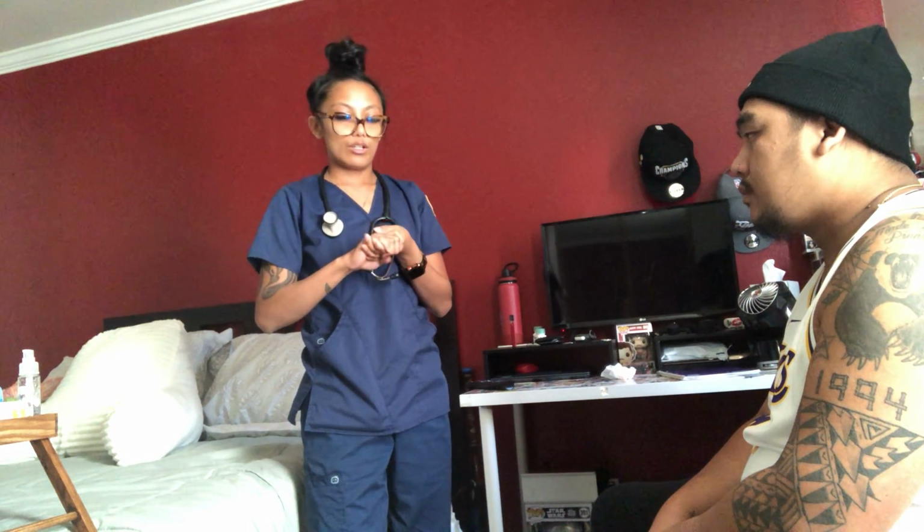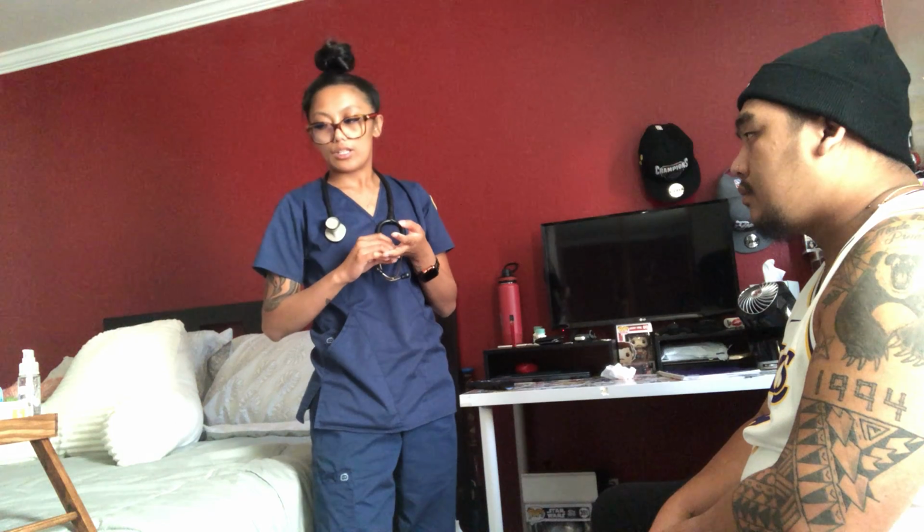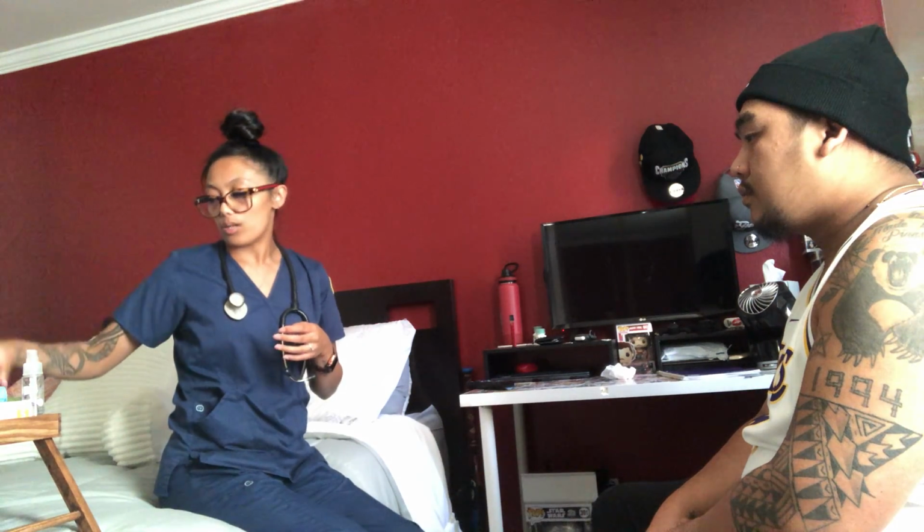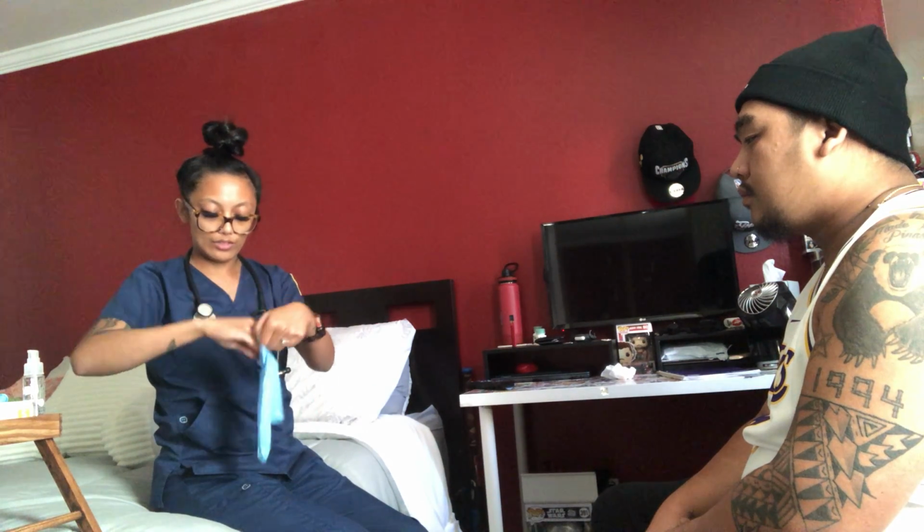I want to make sure that I practice the patient's 6 rights, including the right medication, right route of administration, and the right to refuse. Today, since he already gave me consent to proceed, I am going to continue. I am also going to put on a pair of gloves.